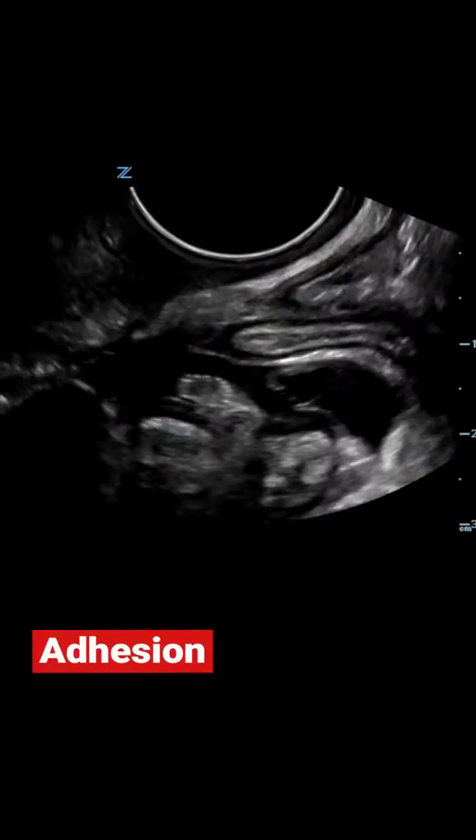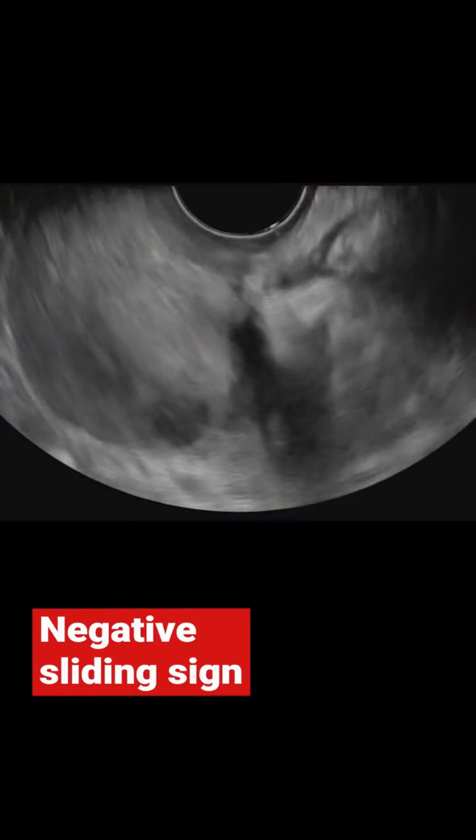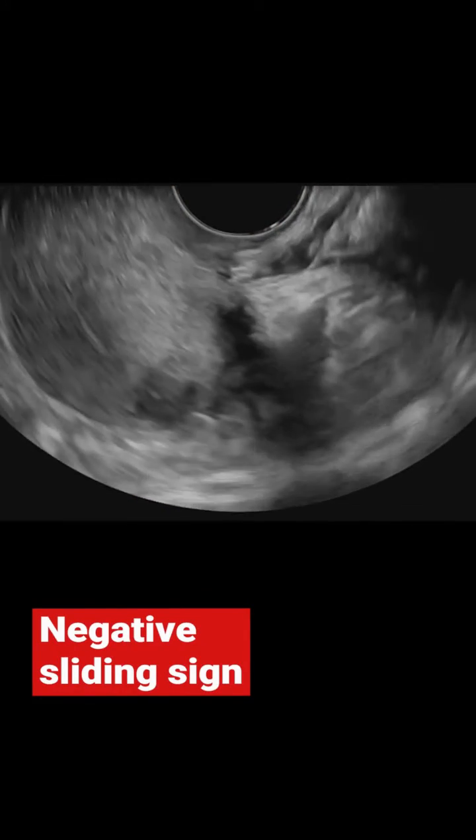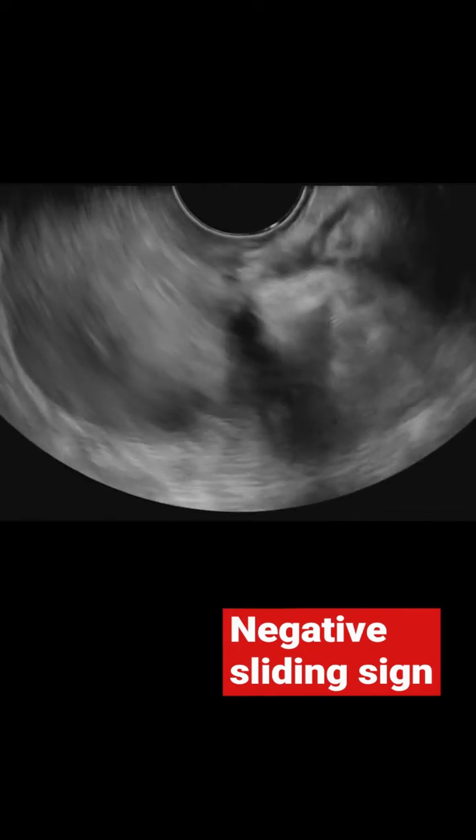Adhesions can be identified by using the dynamic nature of ultrasound — a combination of moving the probe in the sonographer or sonologist's right hand and using the other hand to push on the patient's abdomen to elicit movement in structures. The two most important types of adhesions to identify are related to the recto-uterine pouch obliteration state, elicited through the sliding sign technique. A positive sliding sign shows that the uterus and the rectum move distinctly from one another, whereas a negative sliding sign means those structures move in unison, indicating they are densely adherent to each other.